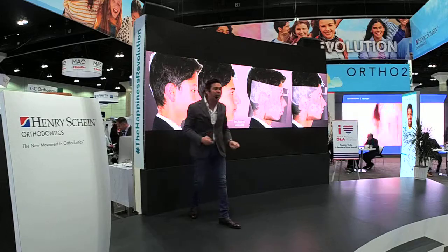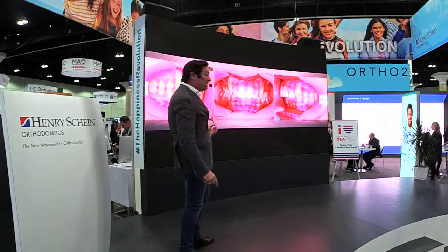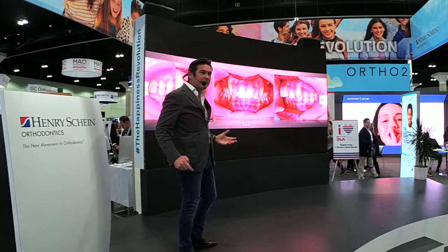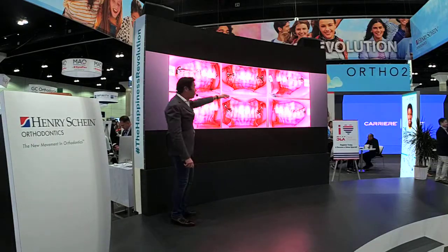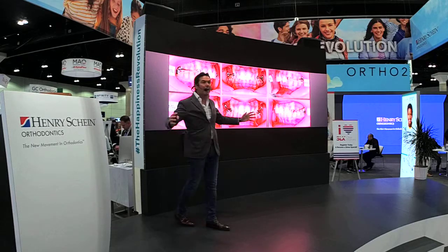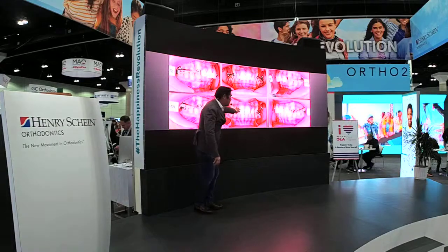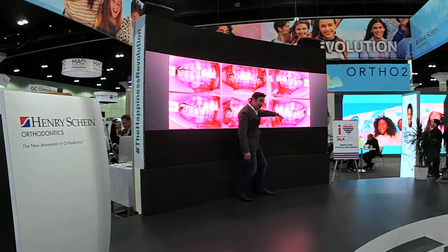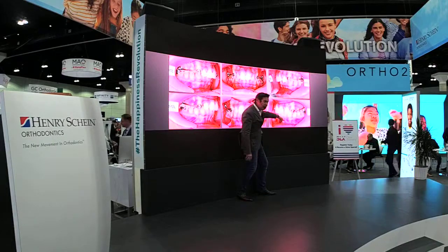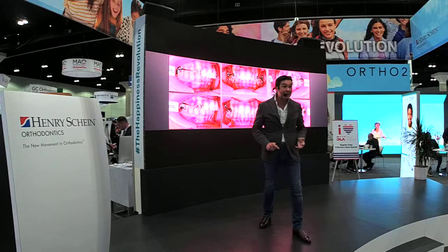Can we shorten that with orthodontics? Of course we can shorten that. This is the scenario of the patient, full step class 2. But we place the motion, and with the motion, in 5 months in this case, we accomplish a beautiful occlusion in class 1. Now, this case, with those spaces, with this overjet that has been reduced because the mandible has been repositioned in the correct position, is easy to solve with braces or with aligners.